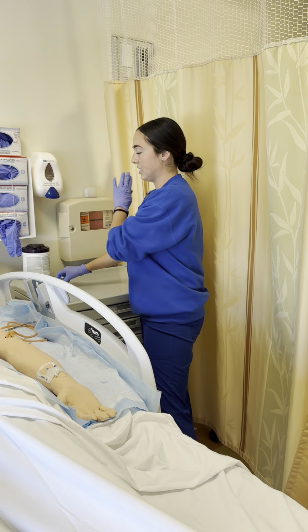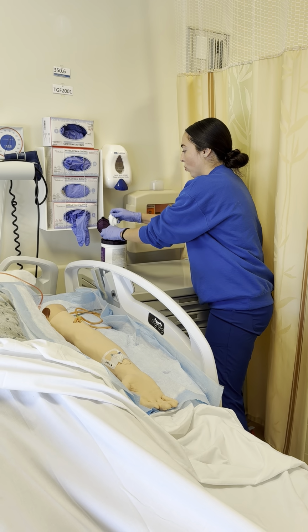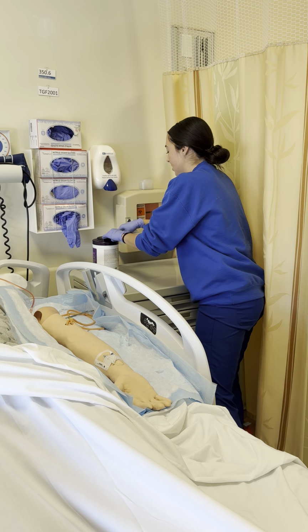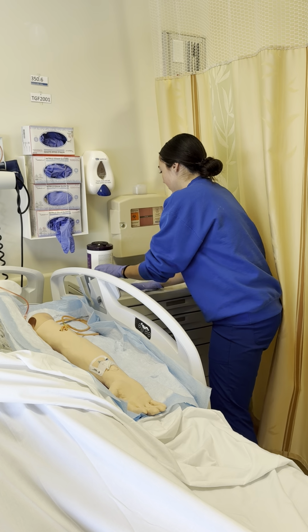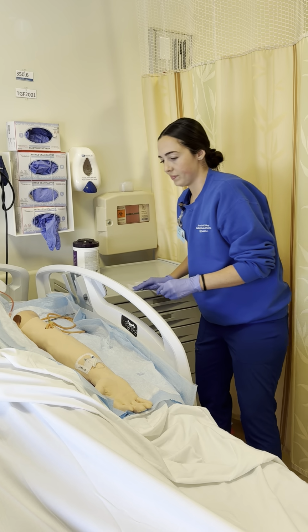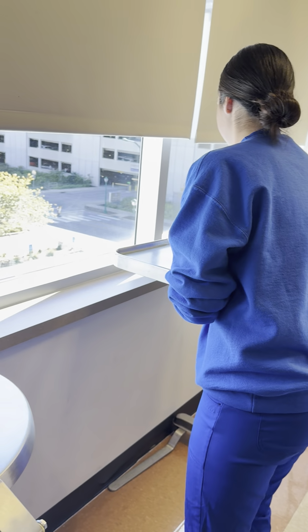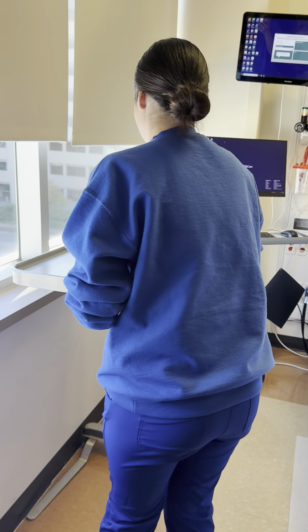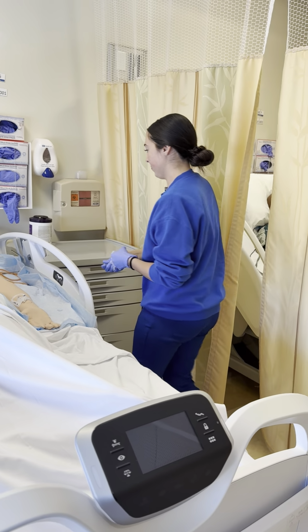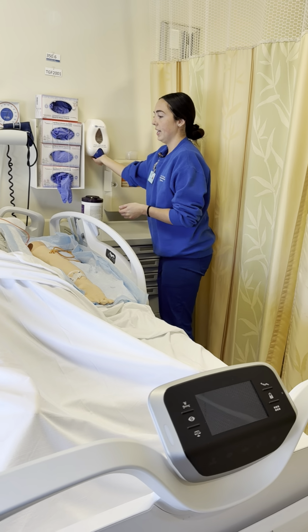All the sharps have been placed into my sharps bin, and I'm going to go ahead and wipe down all of my areas. I'm going to perform hand hygiene.